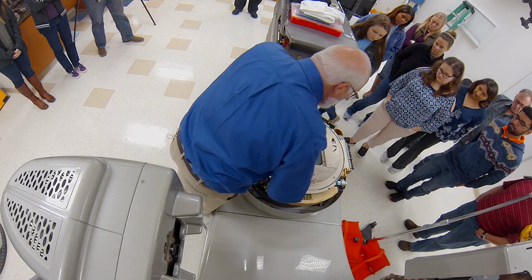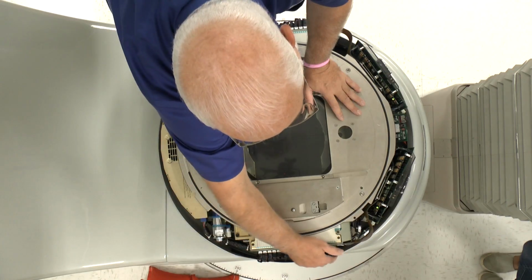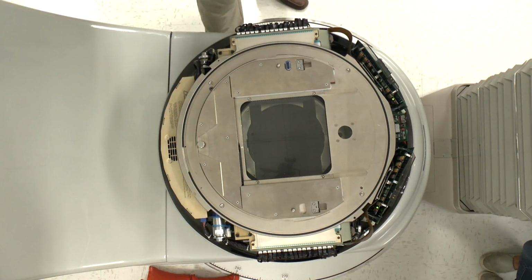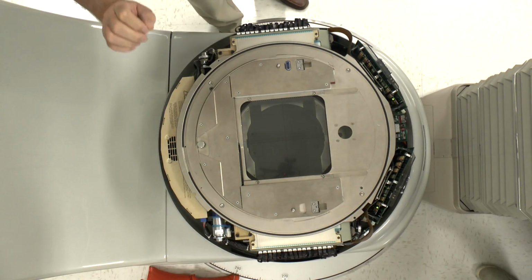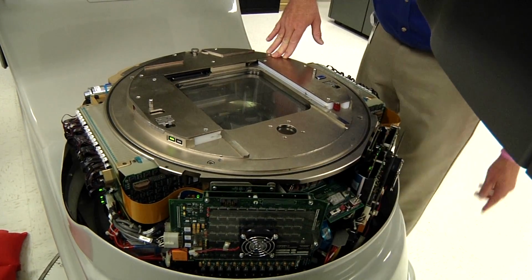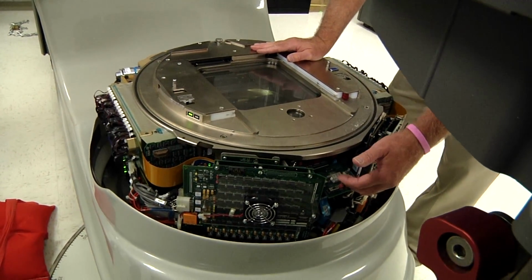So the components of the MLC, we said the power supply. We talked about the motor interconnect board. So these are all the wires that are on the motors. A soft pot. So this is a soft pot. What a soft pot is, it's a variable resistor that has a membrane instead of wires. This is the sandwich board. You got your head transceiver and your motor driver. Below here you have your power distribution board. And then in the middle you have your service panel.